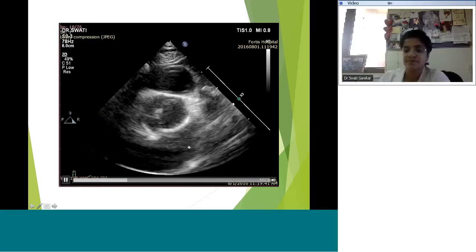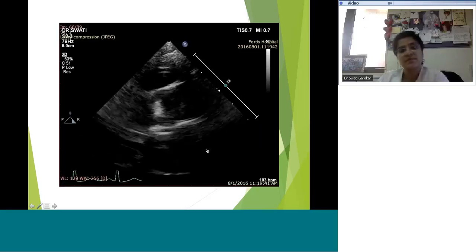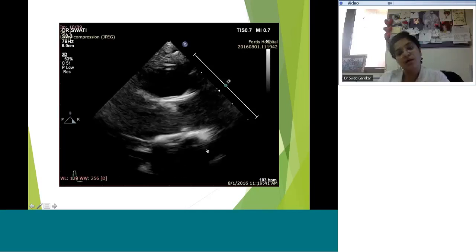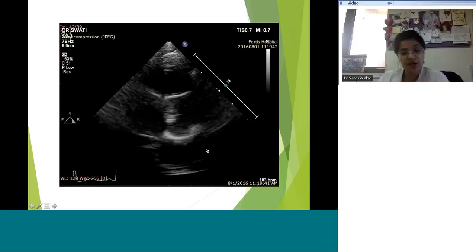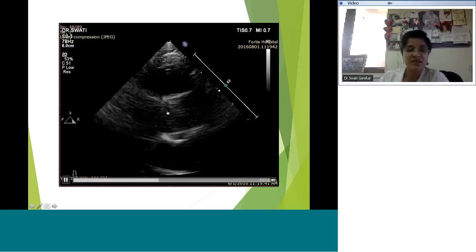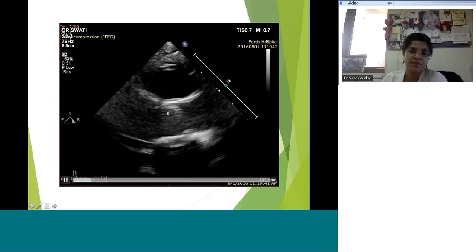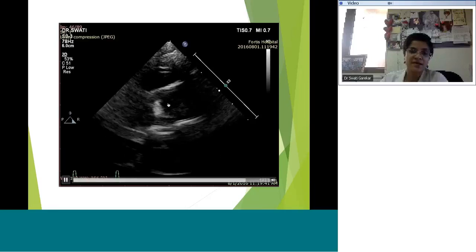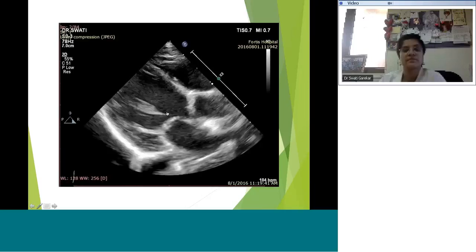All right, so let's move on. Here's the parasternal long axis view. Even if you've started with this view and have not seen the short axis, even then it strikes you in this view that the cusp is abnormal. It's thickened. Not only that, it's not moving properly. It's not flattening out against the ascending aorta. It remains in the LVOT.